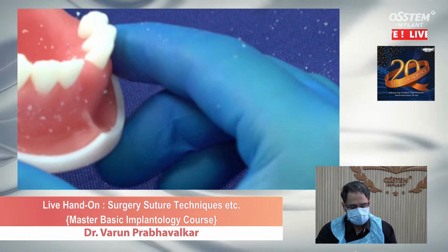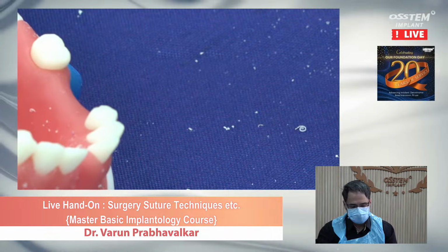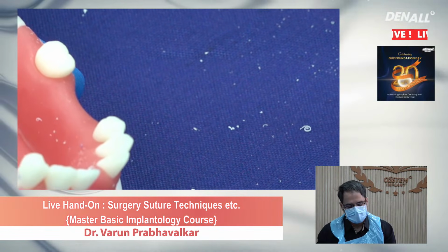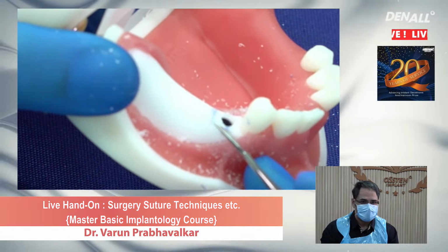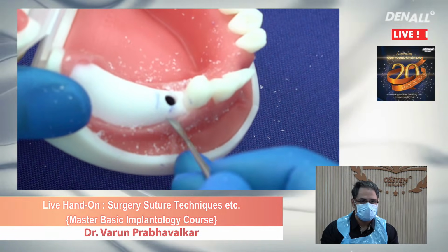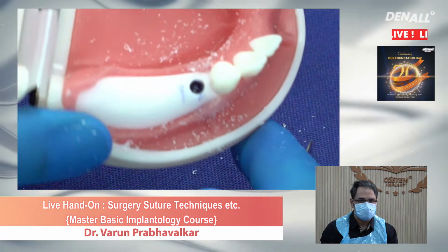Okay, this is submergence, what you can see, of around 1 millimeter. That's what is desired over here. 1 millimeter of submergence of implant, and that's the positioning.